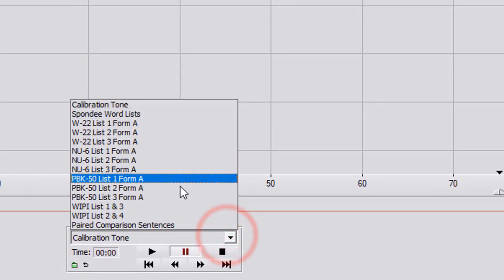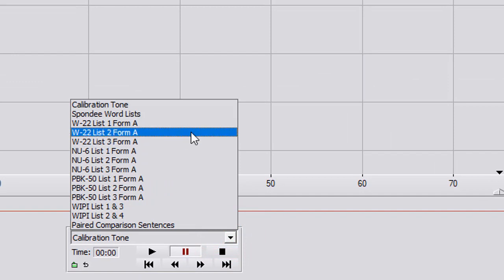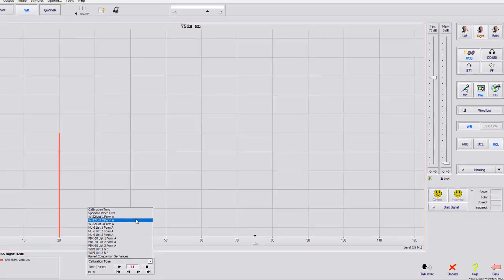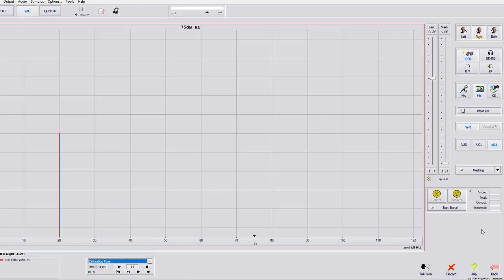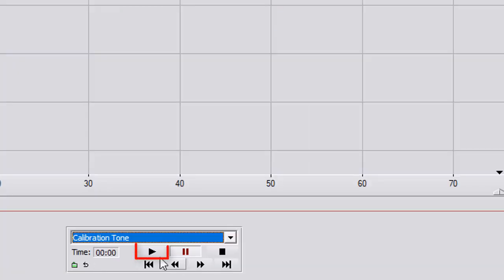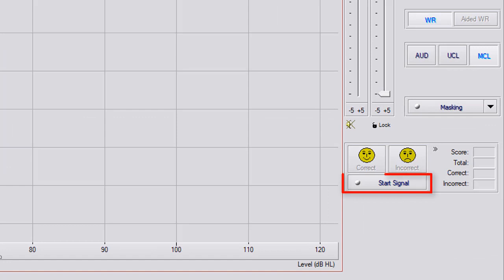You can put in the rainbow passage down here and just basically say, okay, Mr. Smith, we are going to play some words and I want to increase and decrease the volume. Let me know when we're at your most comfortable listening level. So you can do a cold running speech by pressing play or start signal.